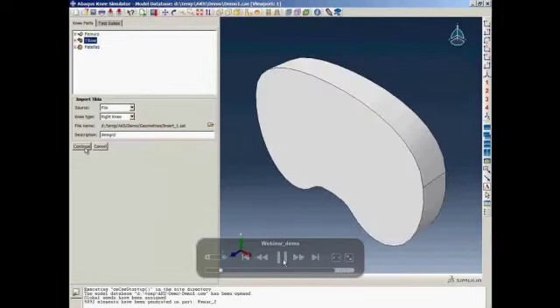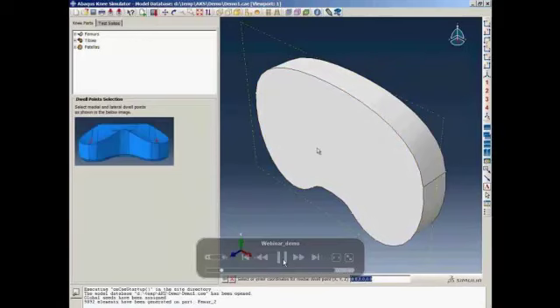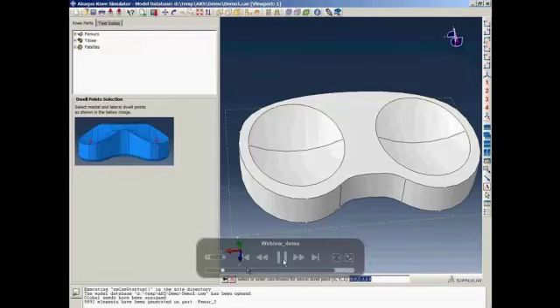Again, different files and different landmarks are provided. So the user needs to pick a plane that's parallel to the transverse plane. Here, instead of picking the points from the screen, we enter the coordinates of the 2 dwell points and the tibia component just to show different options.